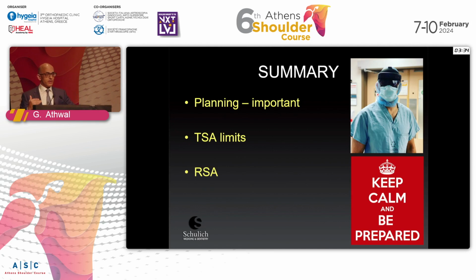So in summary, I think preoperative planning is important, whether it's just looking at x-rays and CT scan, eventually go into software. I think it helps us become better surgeons. Understand what your limitations are for total shoulder arthroplasty, and when those limitations are surpassed, I think we've been shown over and over again that reverse shoulder arthroplasty is a great bailout operation. It's probably going to become the gold standard in the very near future.